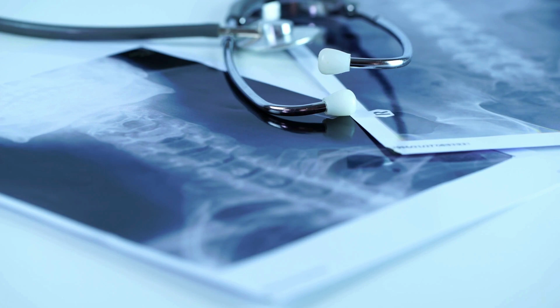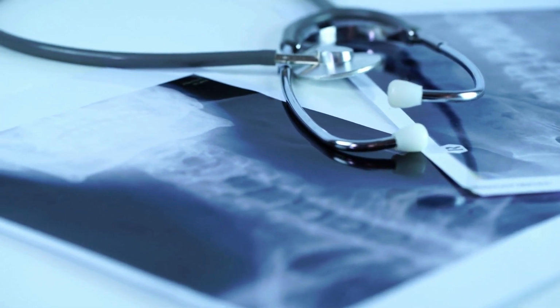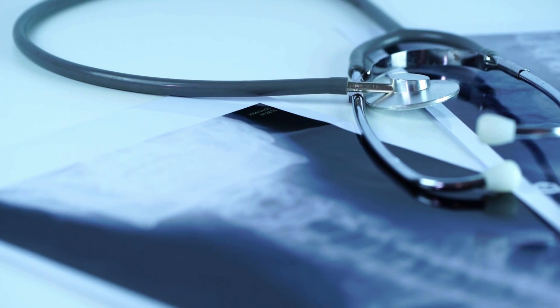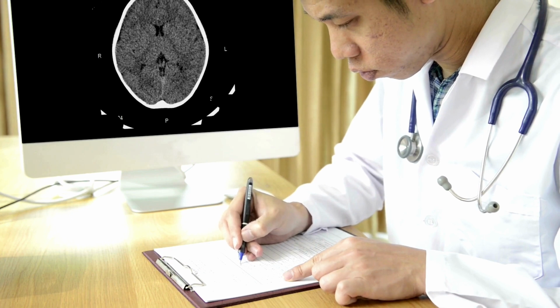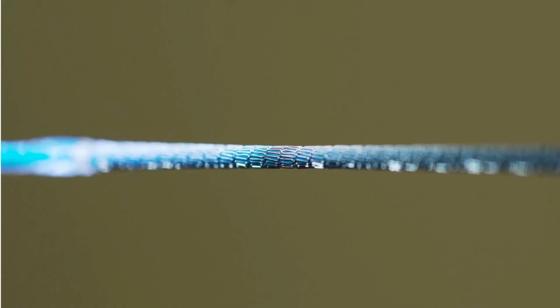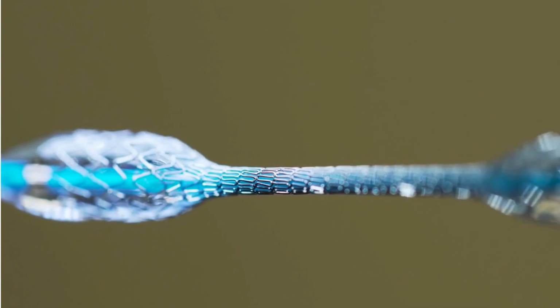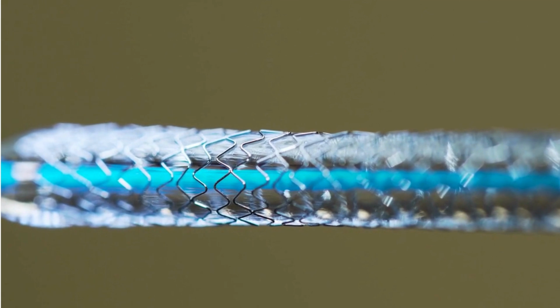Use of cath lab. The cath lab is primarily used for the following procedures: angiography, imaging of blood vessels, particularly coronary angiography to visualize the coronary arteries. Angioplasty, a procedure to widen narrowed or blocked blood vessels, often involving the use of a balloon-tipped catheter. Stent placement, inserting a small mesh tube, a stent, to keep a narrowed blood vessel open. Electrophysiology studies, mapping and ablation of abnormal electrical pathways in the heart.